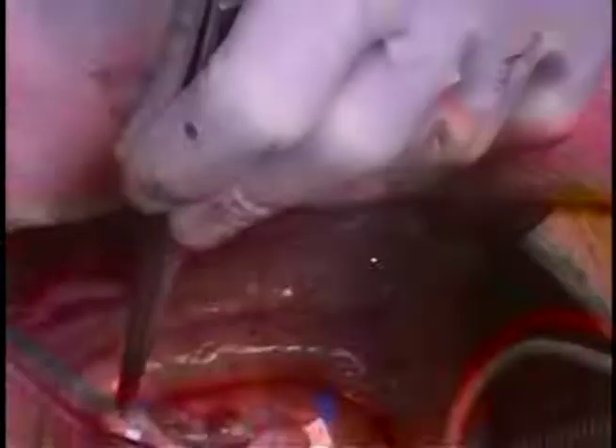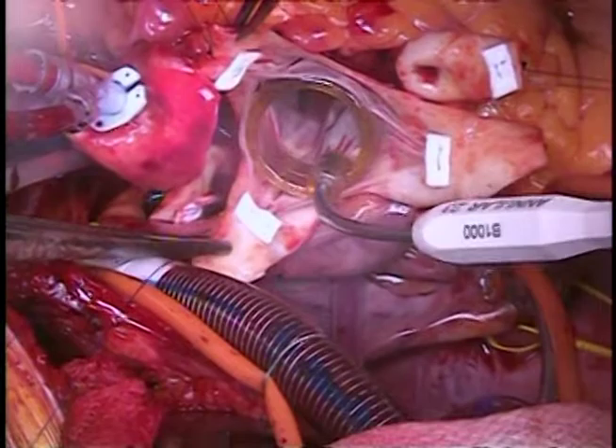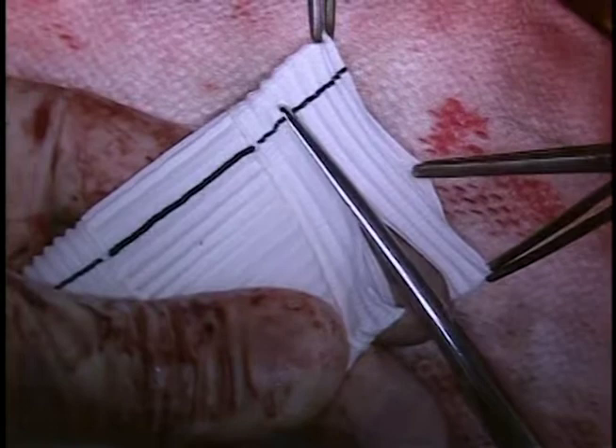We size the valve with a standard valve sizer and simply go up by 5 millimeters when choosing the Valsalva graft size. In this case, a 25-millimeter valve orifice will need a 30-millimeter graft. Here we trim the base of the Valsalva graft until only three rings are exposed.